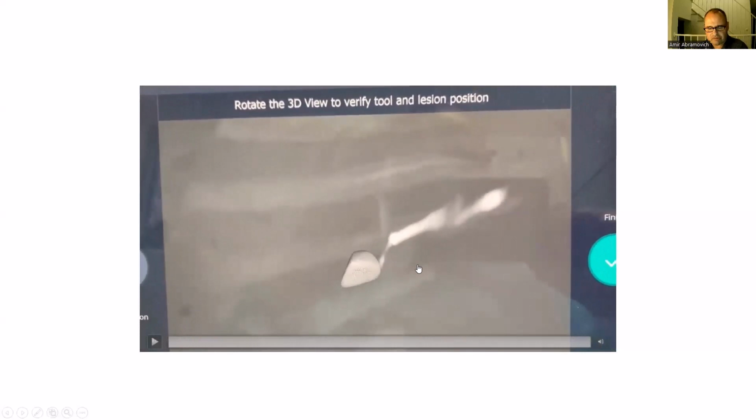So this is how the system now works, and these are the capabilities of the system. I think that for most nodules now, even small ones, I don't use cone beam CT. I think that for more than 90% of the nodules that you are after, even if they are very, very small, you can use the LungVision instead of cone beam CT, and I use them both.